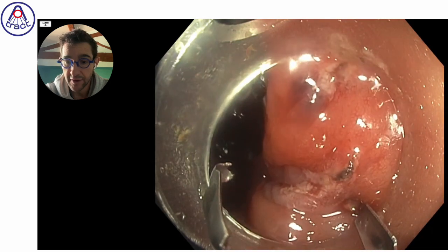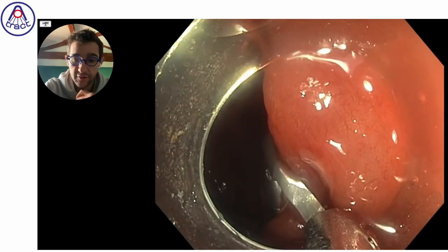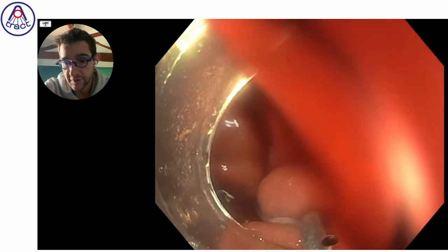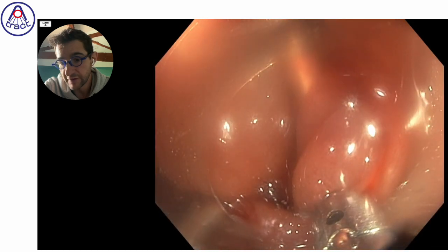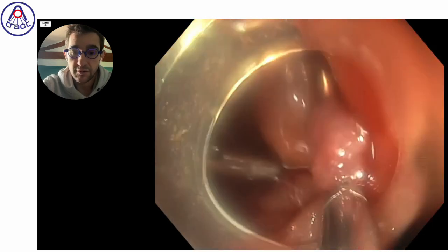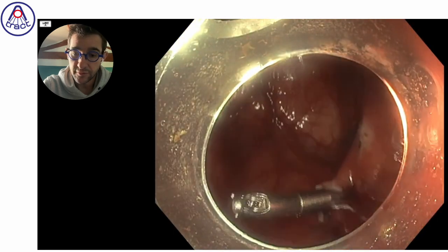well the area. So once again, I tried to put my teeth in the small incision I made, because it makes the procedure really easier, and therefore I go to the opposite edge. Sometimes it's difficult to find another small hole, but once you get the second edge of your ulcer, it's really easy to close.